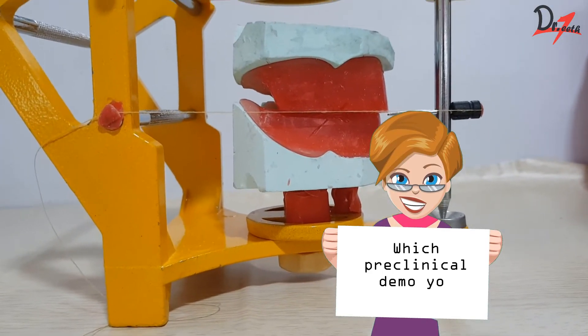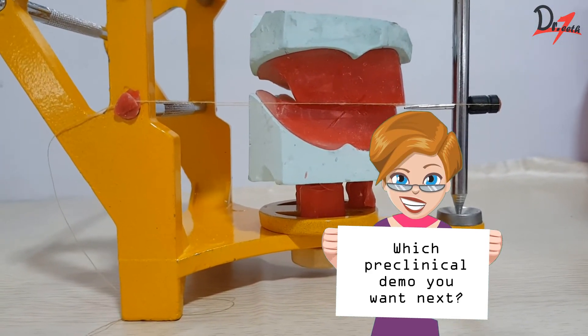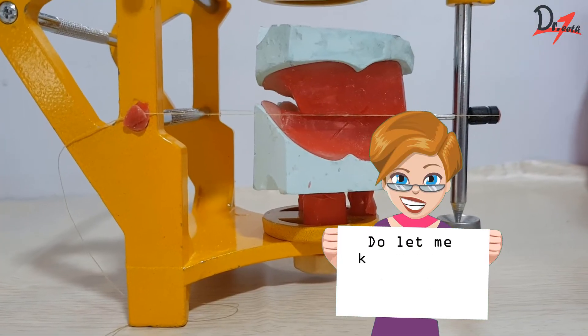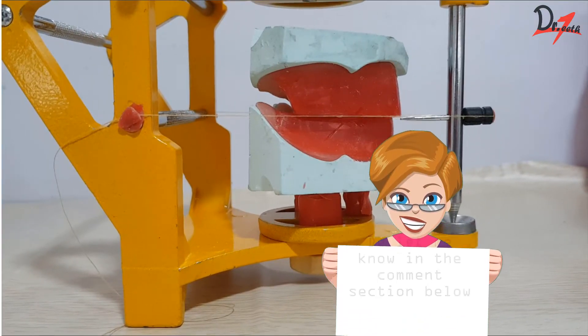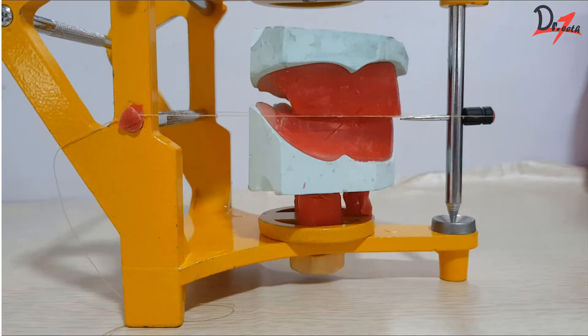Similarly, check from the right side and see the thread relation. Keep your eye at the level of the thread. Make sure that the thread on the left hand side and the right hand side should coincide as well as they should coincide with the plane of the occlusal rim also.